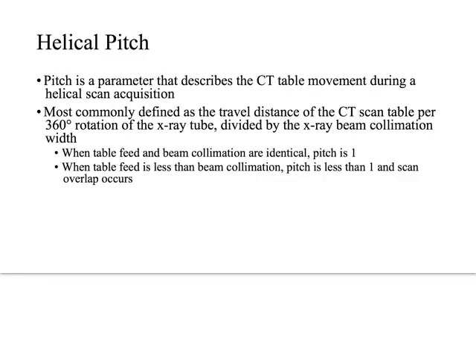So it exactly matches the table movement with the width of the slice in a pitch of 1. If the table is moving less than the thickness of the slice, then we will have a pitch of something less than 1. Right? It would be that much more sensitive because the slices are that much closer together. The table's not moving as much.